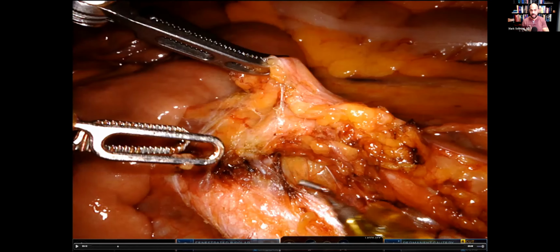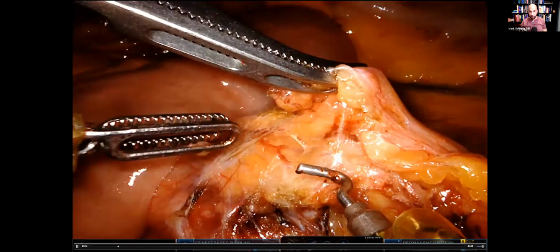This specific patient had an obstructing cancer that tethered her rectosigmoid junction to the pelvis. And so there was a difficulty in me pulling things up. So I wanted to kind of do the vascular ligation first in this specific case. So that's why the angle is like this. But in the average patient, you want to get that so that the IMA is sticking north-south in this case. So that's the first point there.